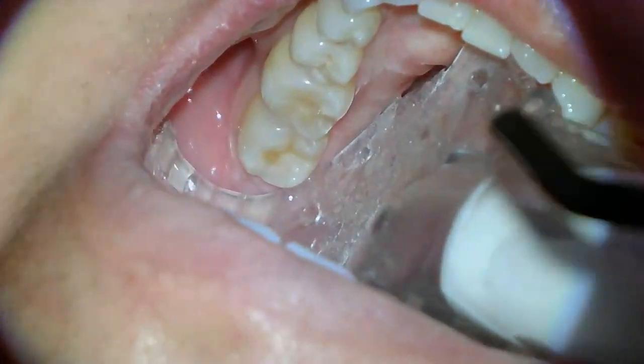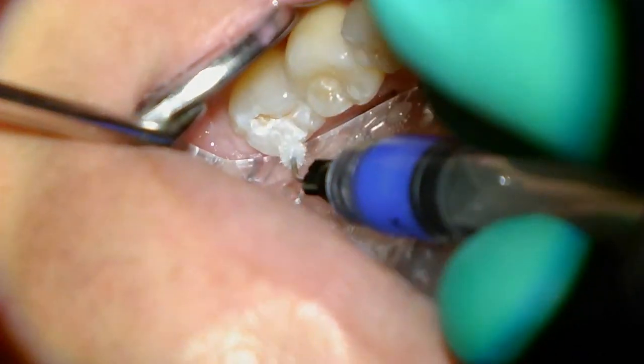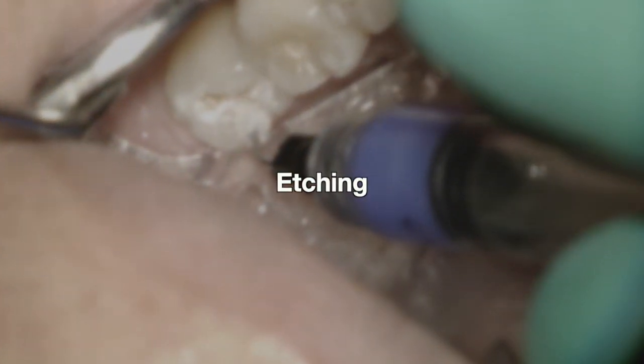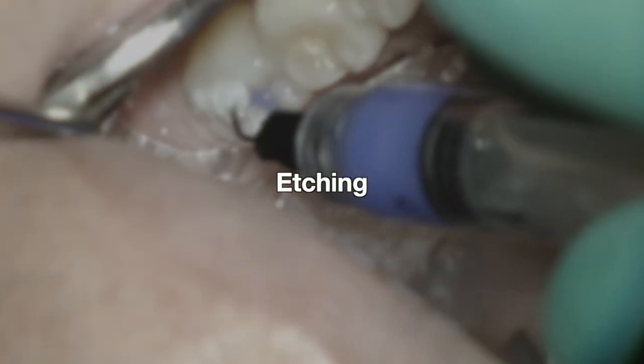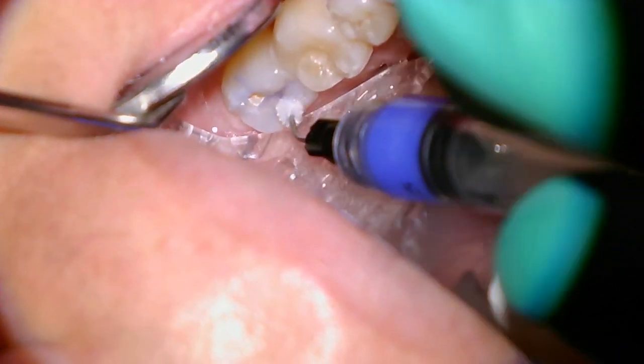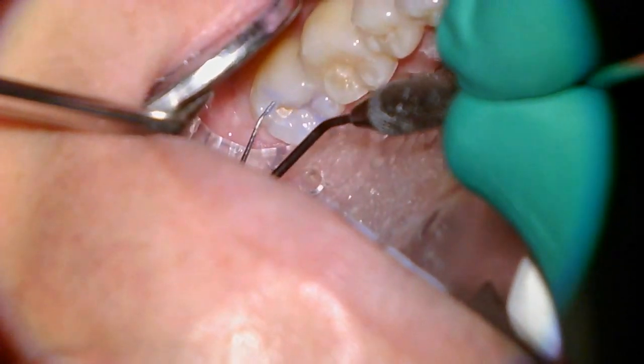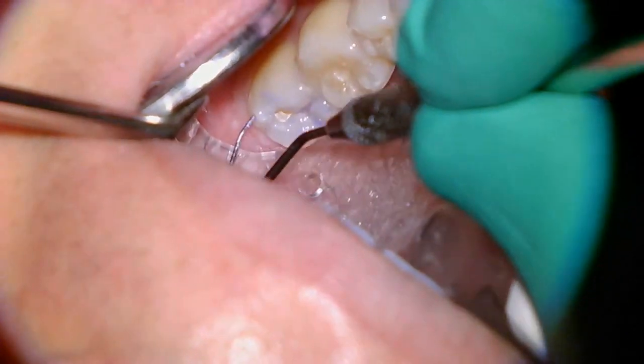Once the doctor has verified that all the decay has been removed, we're going to start the process of etching. In this case it's selective etching, so the etch is being applied for about 15 seconds only over the enamel, and what the etch is doing is basically roughing up that enamel so that we can have a good bonding surface.